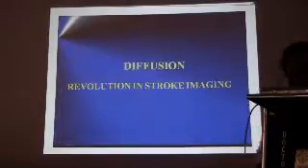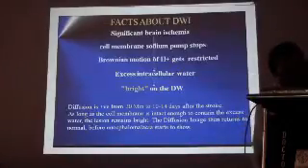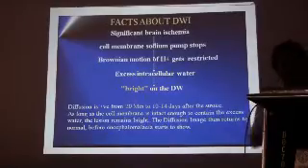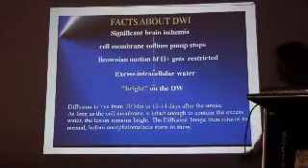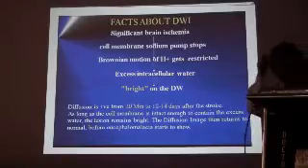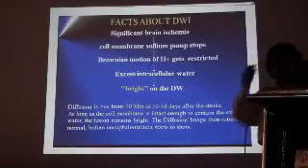Okay. Now, diffusion imaging has revolutionized stroke imaging. Now, what is diffusion? Essentially, the cell membrane sodium pump stops if there is ischemic insult. The Brownian motion of hydrogen atoms gets restricted, there is excessive intracellular water, and, as I have told you, basically in MR we pick up the proton density.